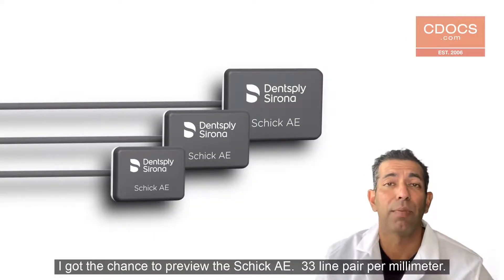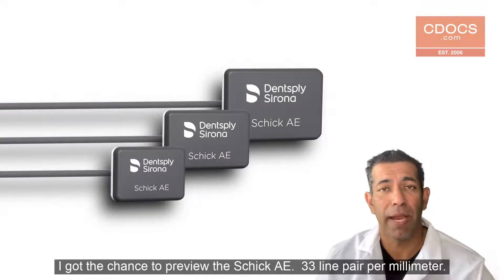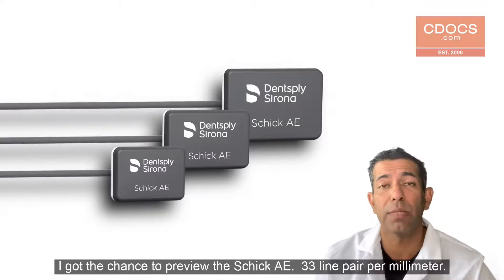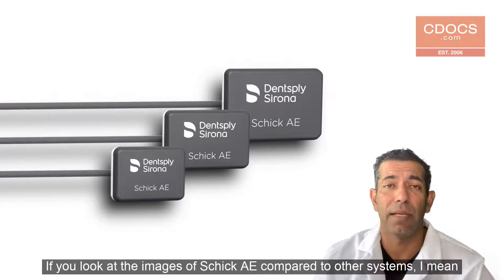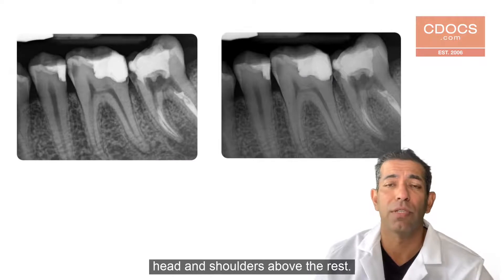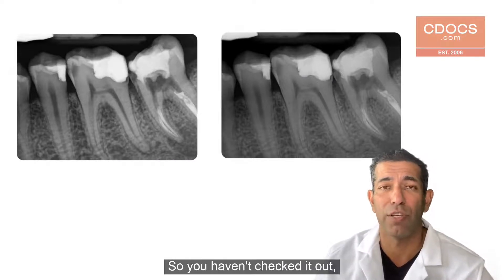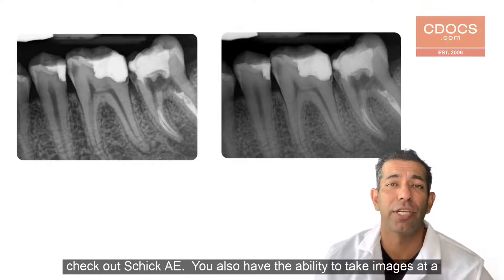I got the chance to preview the Schick AE — 33 line pairs per millimeter, really crisp, clean images. And if you look at the images of Schick AE compared to other systems, head and shoulders above the rest. I was really impressed by the quality of them. So if you haven't checked it out, check out Schick AE.